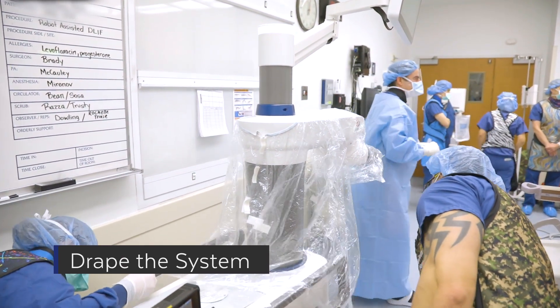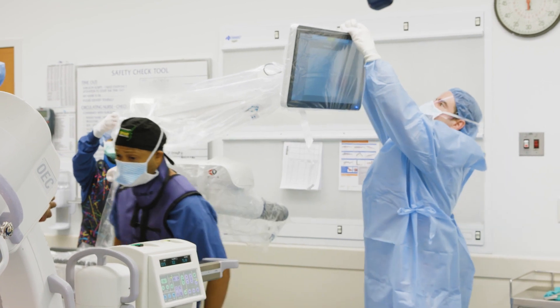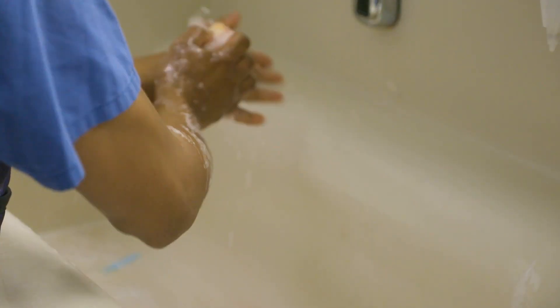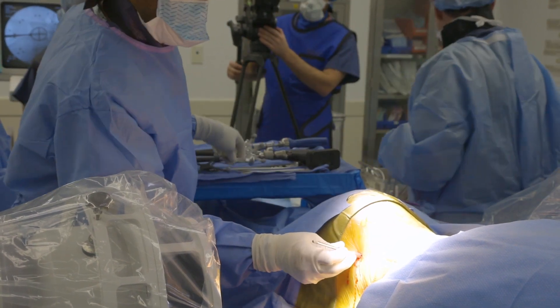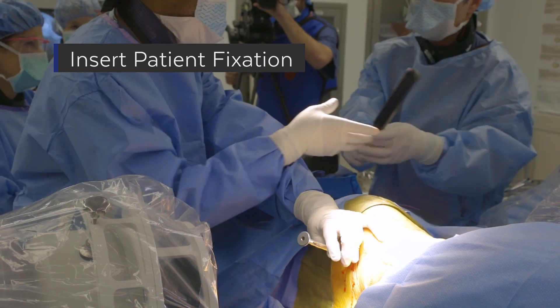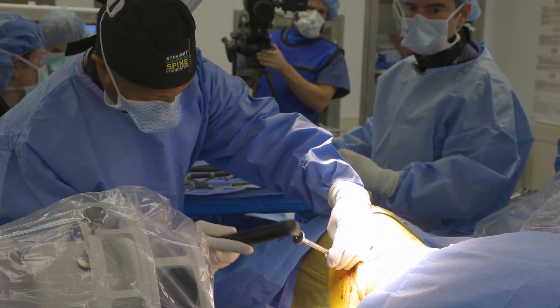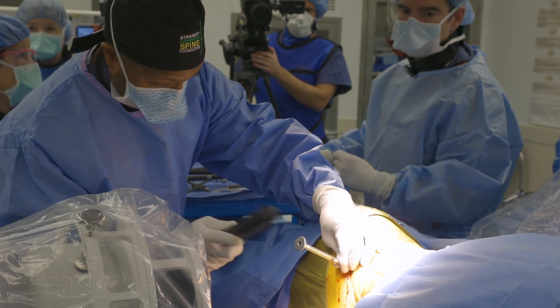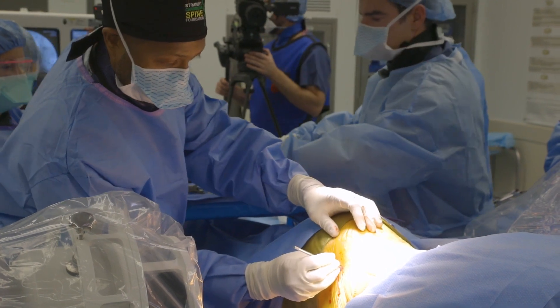Here you can see draping of the Excelsior GPS robot that is going to be brought into the field. Here you see placement of the DRB — usually placed on the upside. I typically like to use the low profile DRB. They have an option between small, medium, and large. Typically I'll use the medium one, and that will allow the DRB to register with the robot appropriately.